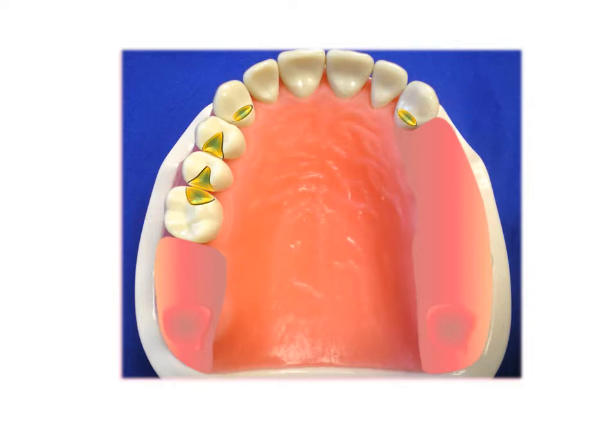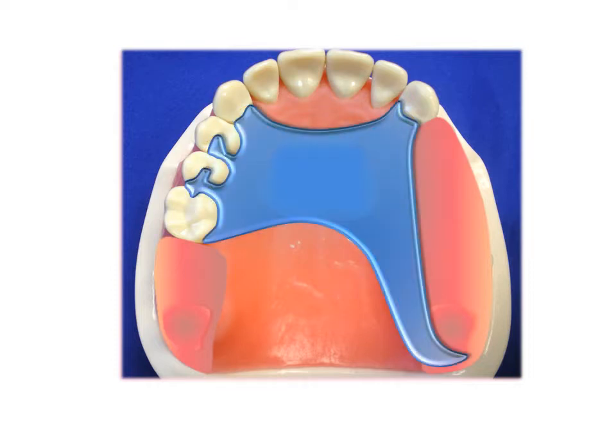Now we're ready to join these components across the arch with a palatal plate major connector. The connector is extended so that the base will cover the tuberosity area. Draw the bead line on the cast. Okay. I think we measured the interarch space and decided we had enough room for an acrylic base with acrylic teeth, so let's draw the ladder base retention.